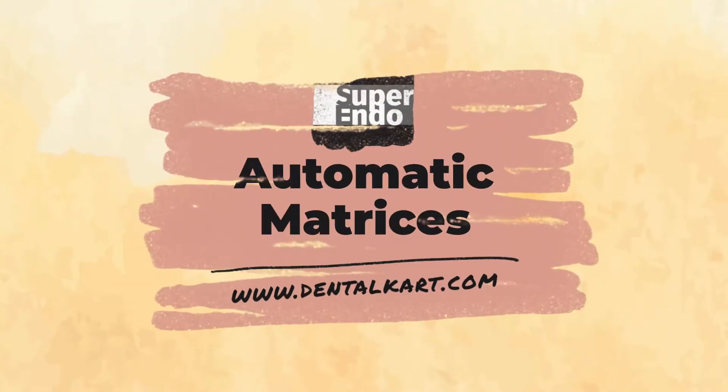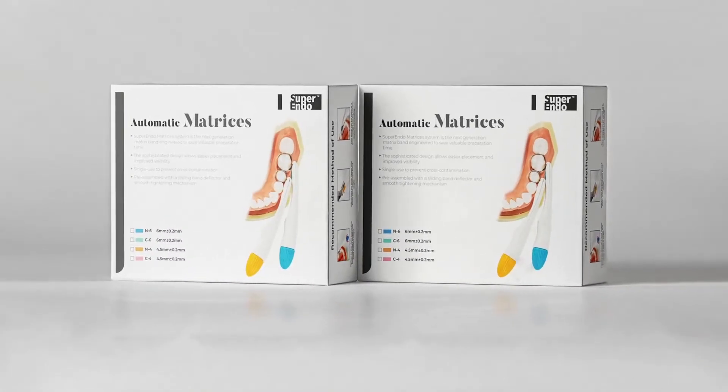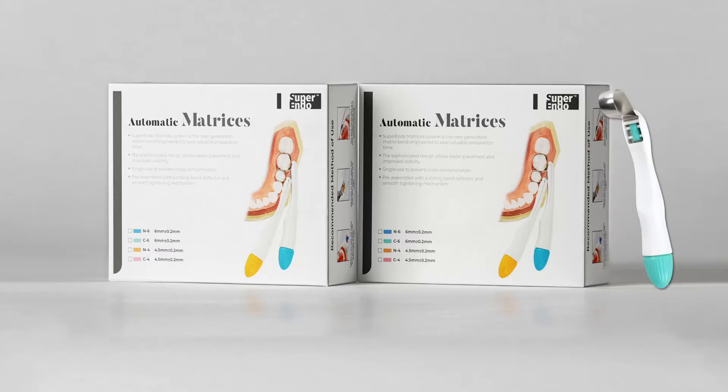Introducing Superindo Automatic Matrices. It is a next-generation matrix band engineered to meet the evolving needs of dentistry.